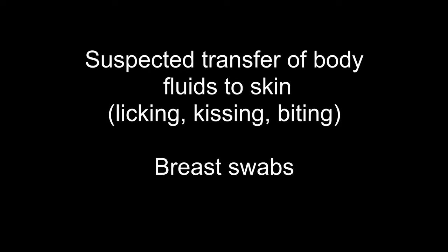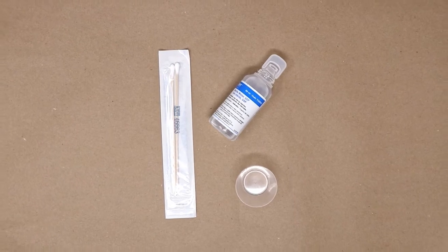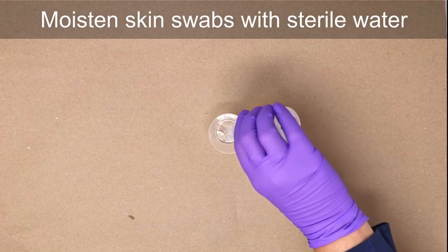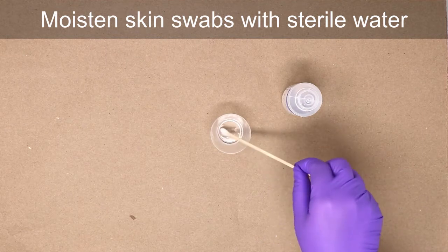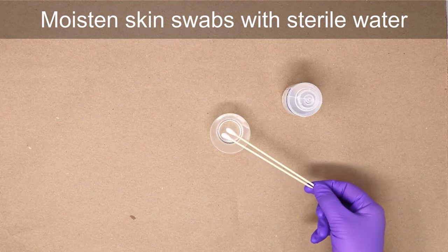They are collected if there is suspected transfer of body fluids to the skin through actions such as licking, kissing, and biting. Breast swabs should also be collected anytime there is suspected or unknown contact with the breasts. Swabs should be moistened with sterile water. This can be achieved by pouring sterile water into a medicine cup and subsequently dipping the swabs into the cup. Moistening of the swabs helps to facilitate the transfer of any dry DNA deposits, such as dried saliva, from the skin onto the swab surface.